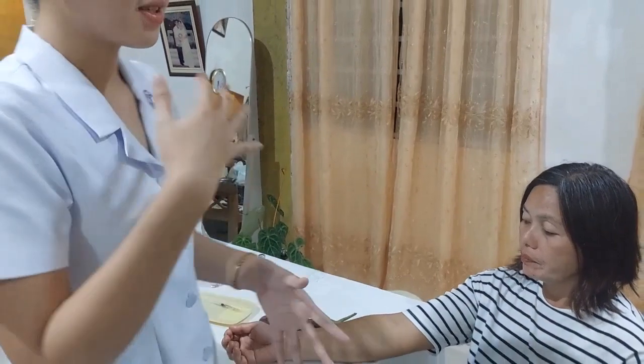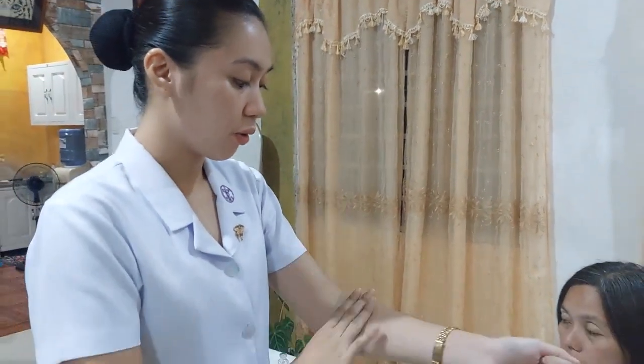Okay, as soon as I have provided my patient's privacy, what I'm actually doing here now is selecting the site for the injection. So the site is the forearm, no? A hand's width just above the wrist, and three or four fingers' width below the antecubital space.